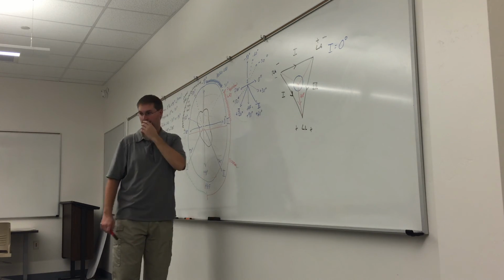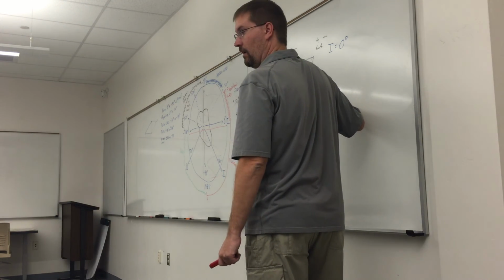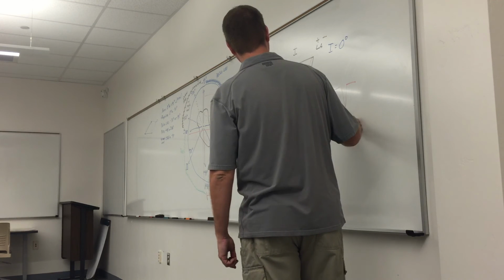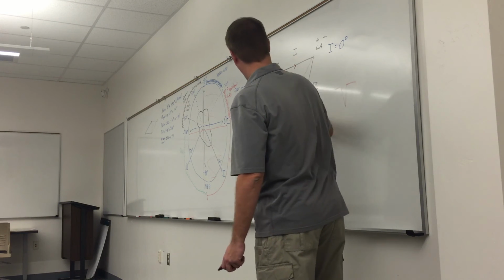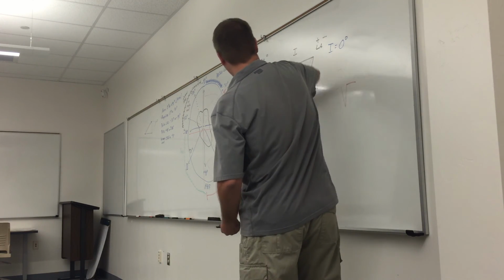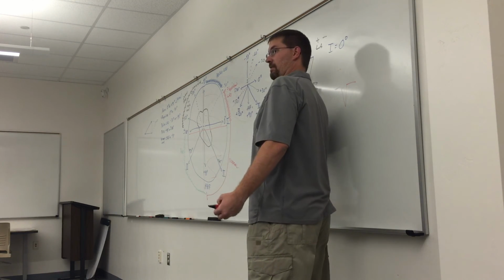No, I'm lost now. Because of the isoelectric line. I think it's because it's moving down, which is negative. Look at the deflection. QRS on AVF. What direction is the QRS moving? Down. It's moving down. Negative. So if it's down, it's moving away from the positive, right? So the impulse is moving in this direction, right? Because AVF looks in this direction here, right? So if it was up, it would be looking the way that AVF goes. But because the QRS is down, you're looking in the opposite direction, up this way here.